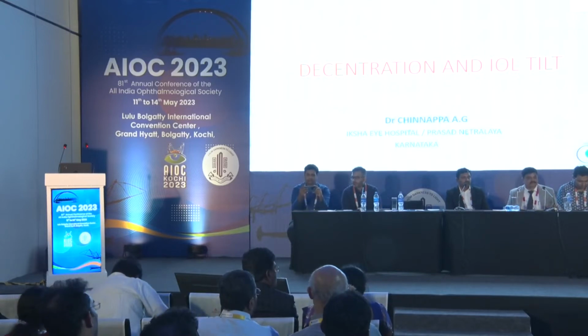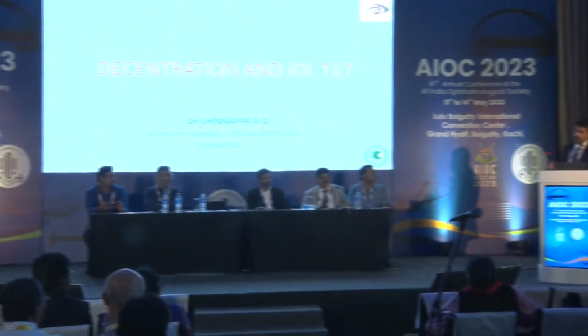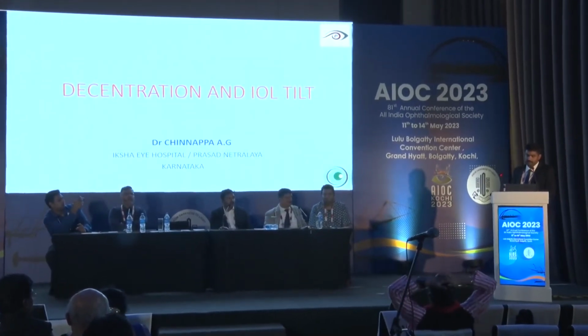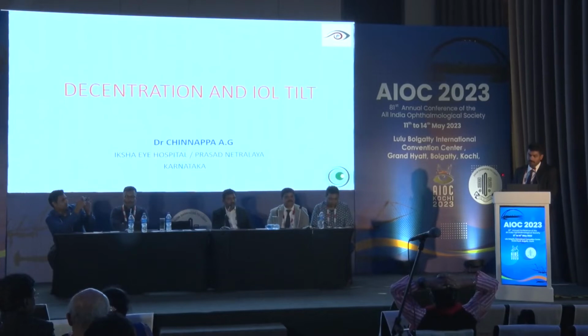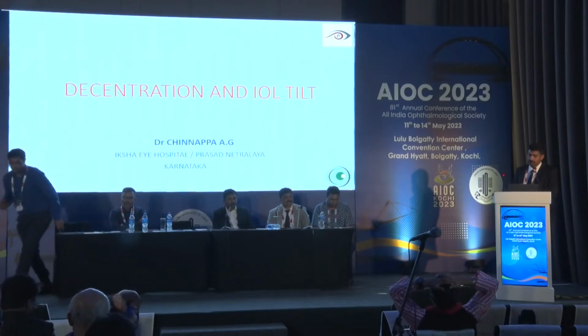Now we saw this mind-blowing talk by Dr. Rohit Shetty about what happens on the surface that makes the patient unhappy after the surgery. Now we go into the eye and try to deal with some problems that happen on the IOL level, which we fail to identify at times. Decentration means there is a defect in the XY axis of the IOL, and tilt means there is some movement on the Z axis of the IOL.